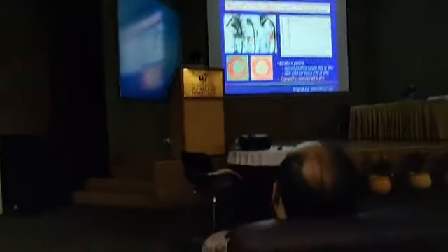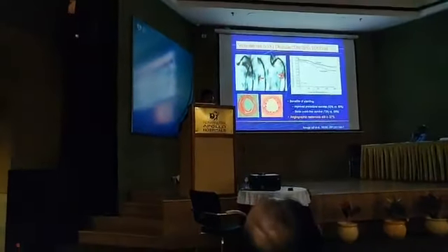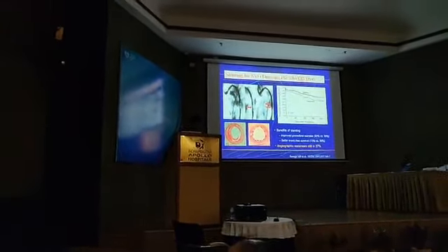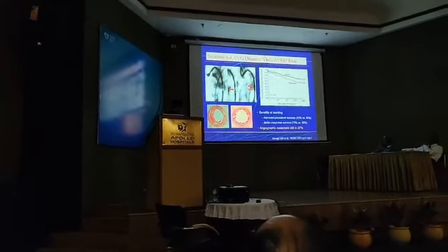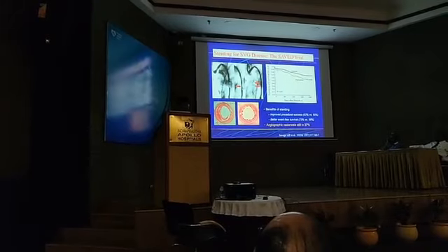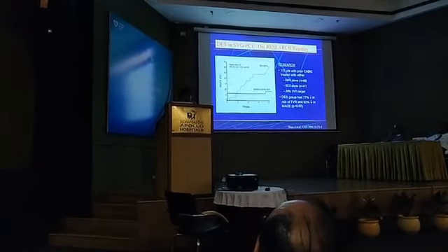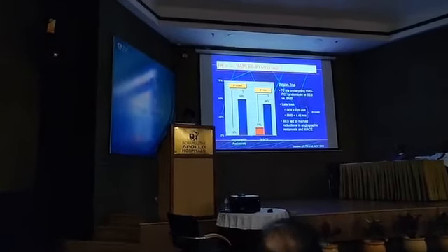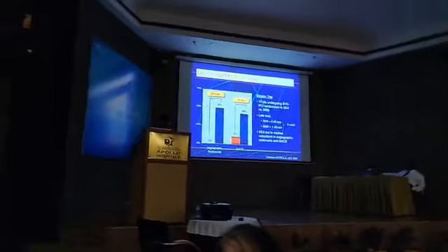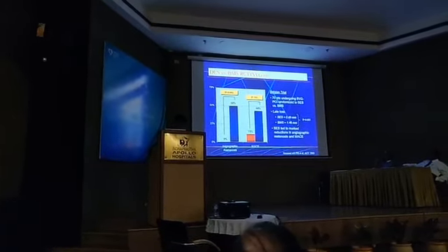Whenever you start a procedure for saphenous vein graft angioplasty, initially it was basically a bare metal stent, and later on they shifted to the drug-eluting stent. We have clear-cut data that angiographic restenosis was still 37% in patients with bare metal stents. Some studies were done, DES versus BMS, and in the Belgian trial they confirmed that if you use a sirolimus-eluting stent, then the late loss is much lesser as compared to the bare metal stent.